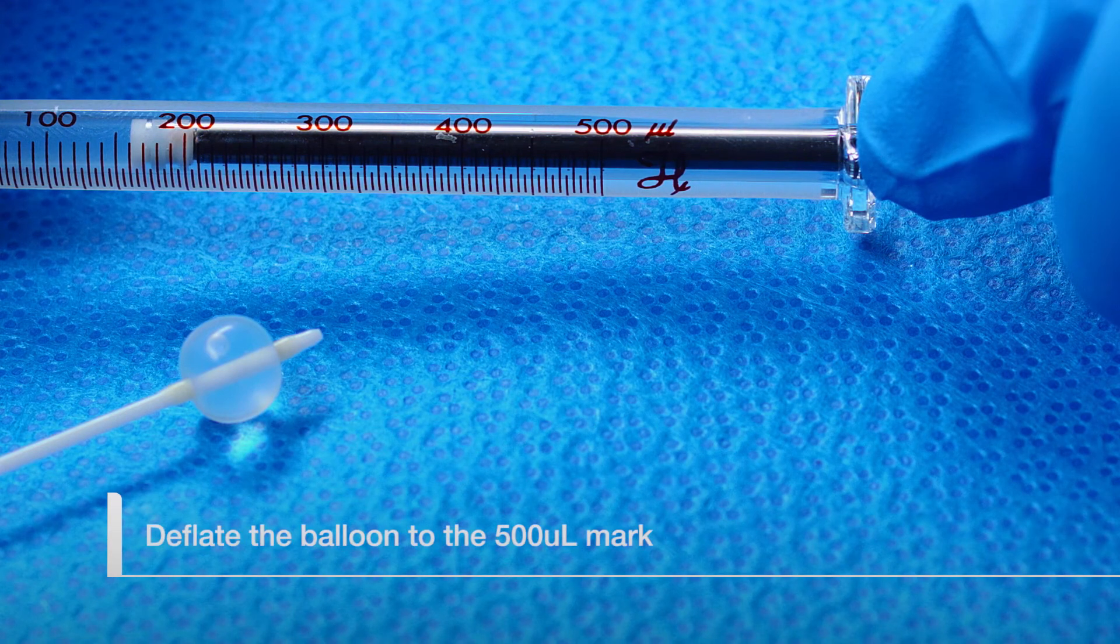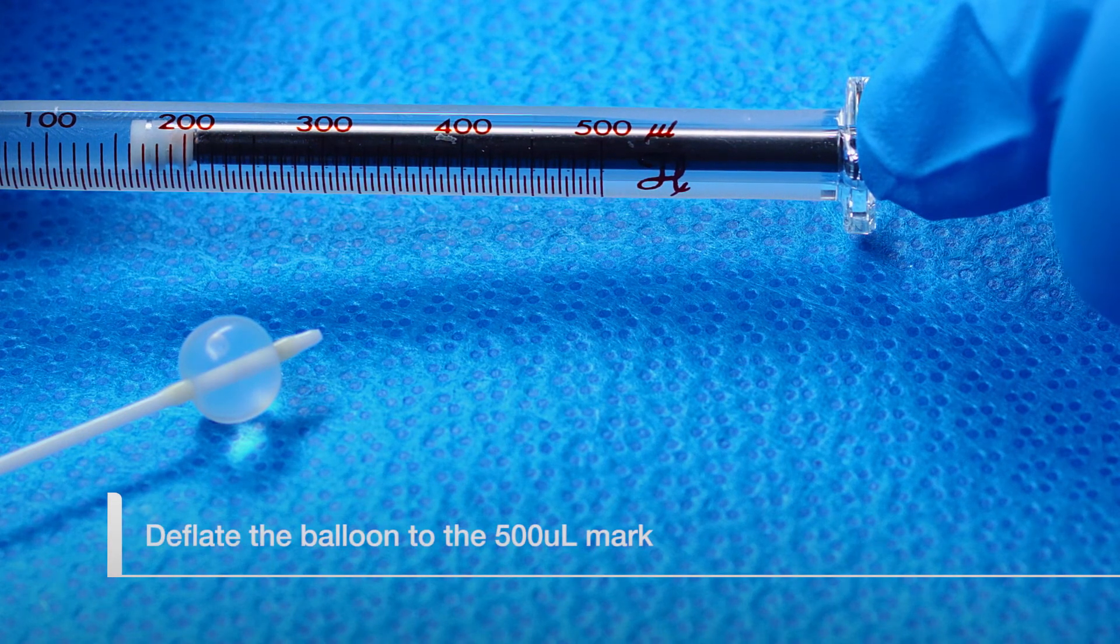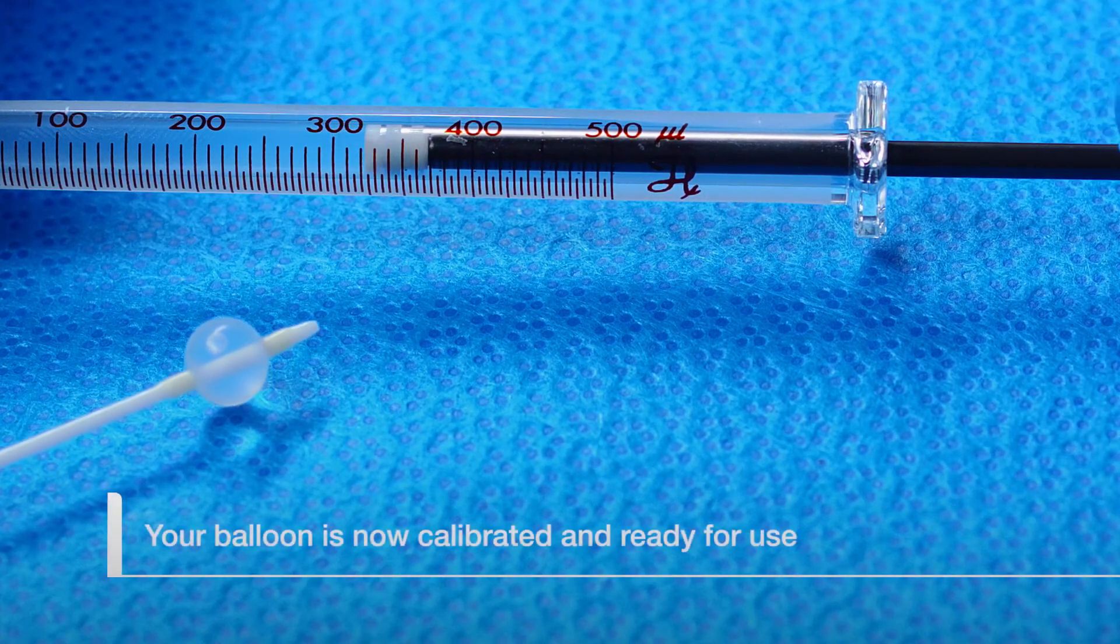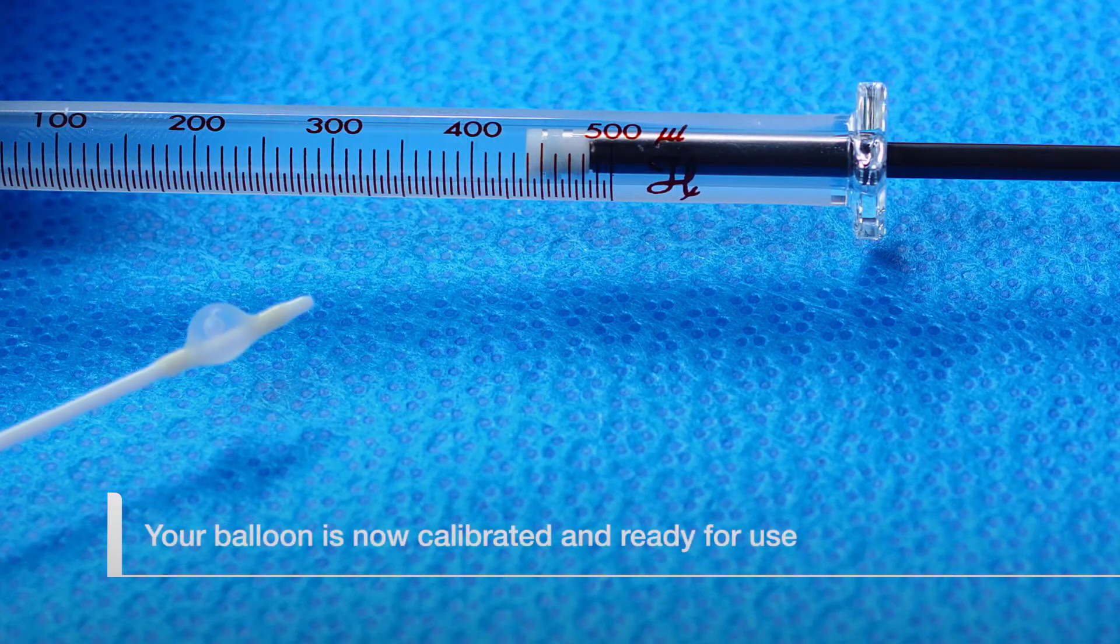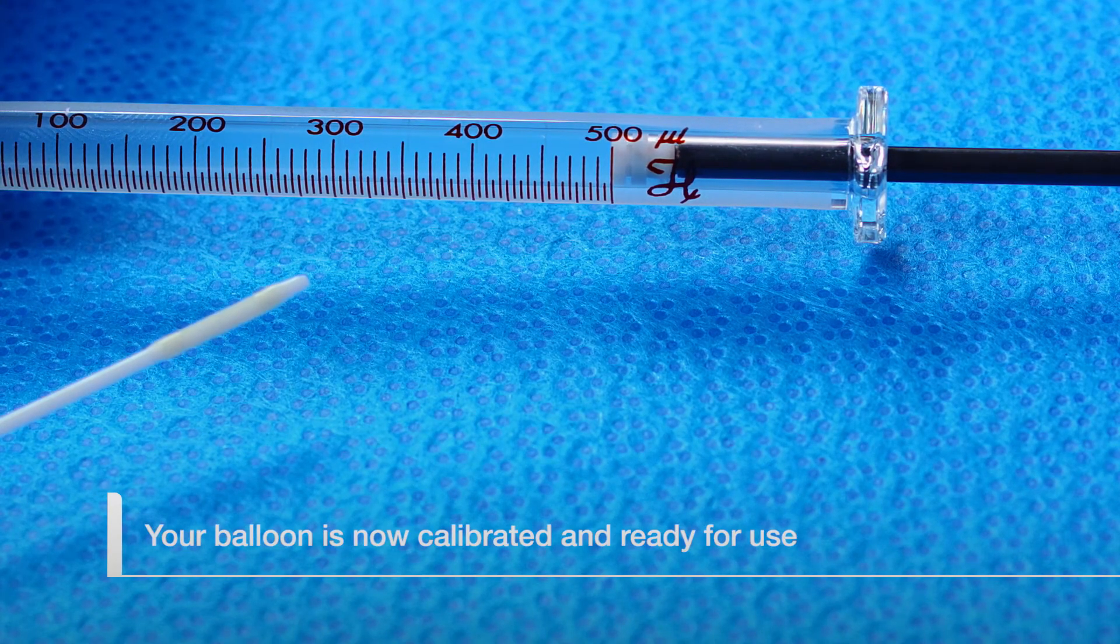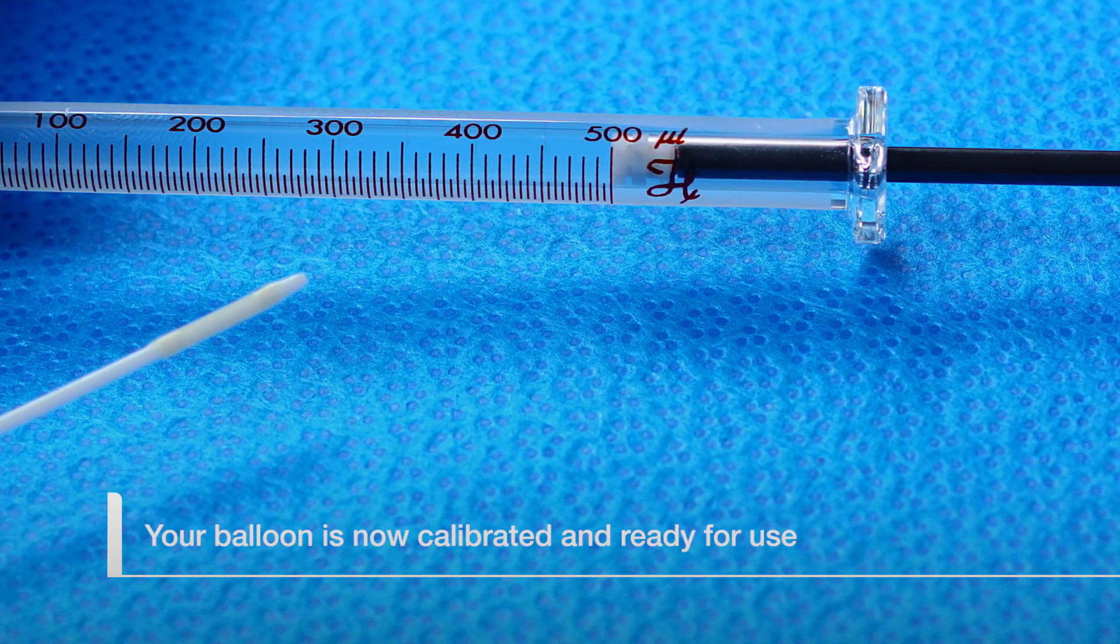Fully deflate the balloon by returning the plunger to the 500 microliter mark. Your balloon catheter is now ready to be used with the Spiration valve system. Cover the balloon with the light-proof cover and place it in a safe, clean area until ready to use in the airway.